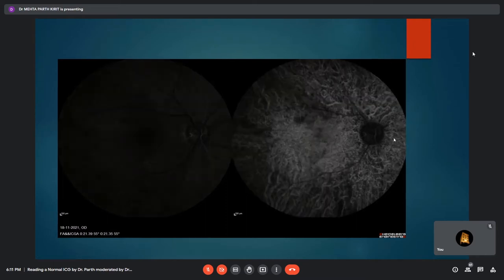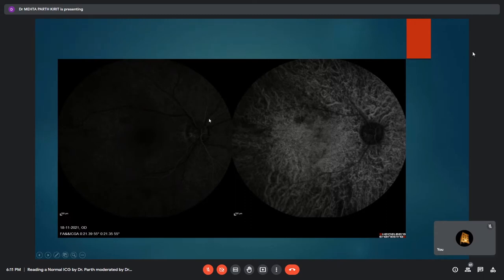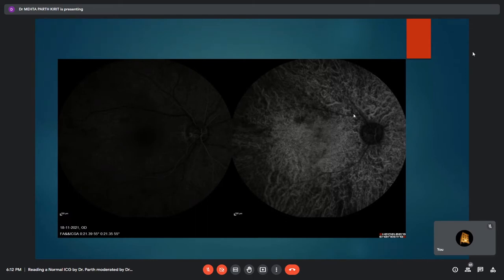In the next segment the choroidal veins are more clearly delineated, and dye has just entered the retinal circulation, which can be seen on the corresponding FFA image as well. The watershed zone cannot be demarcated in this case but generally appears as a hypofluorescent area adjacent to the disc in the early phases, representing the area between the supply territories of each posterior ciliary artery.